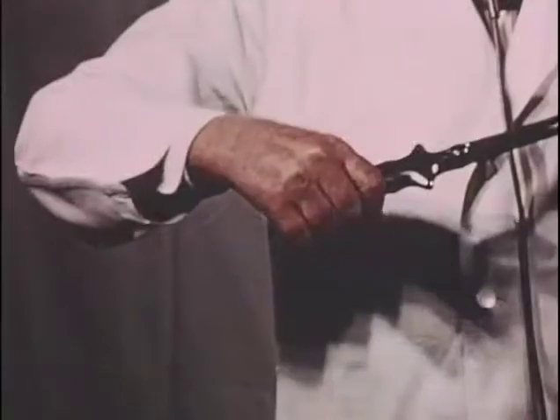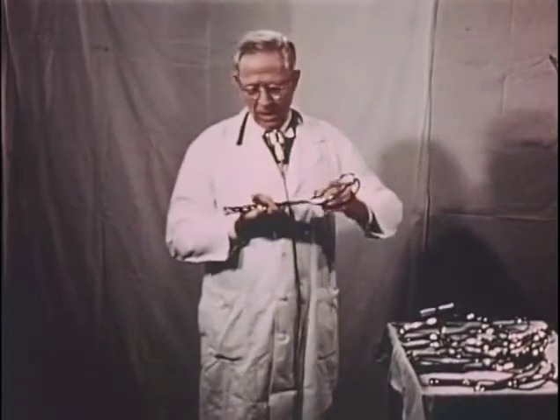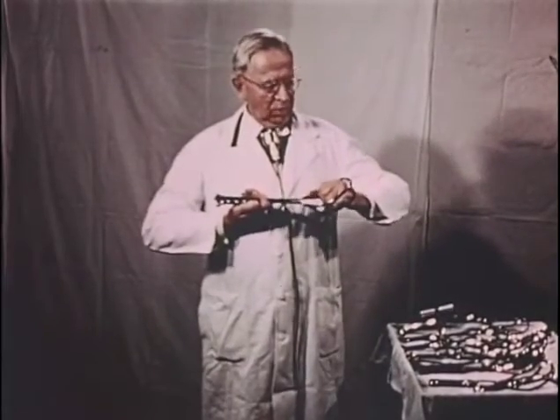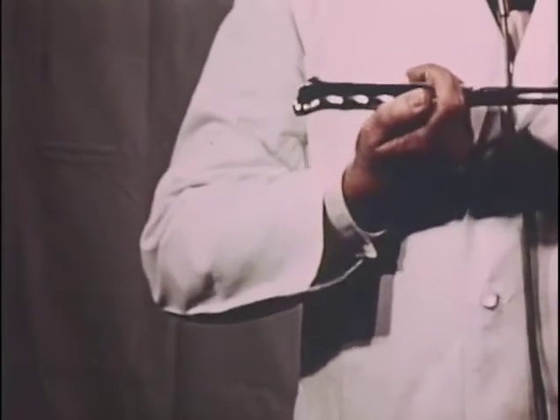Here we have a first-degree lever, the hand exerting the force on the handles, compressing the handles, and it's transmitted to the resistance, the fetal head, with the lock as the fulcrum. However, if we apply traction to the finger guards, we utilize the principle of a third-degree lever and apply our force at the fulcrum, thereby avoiding compression of the handles, which may give transmitted compression to the fetal head.